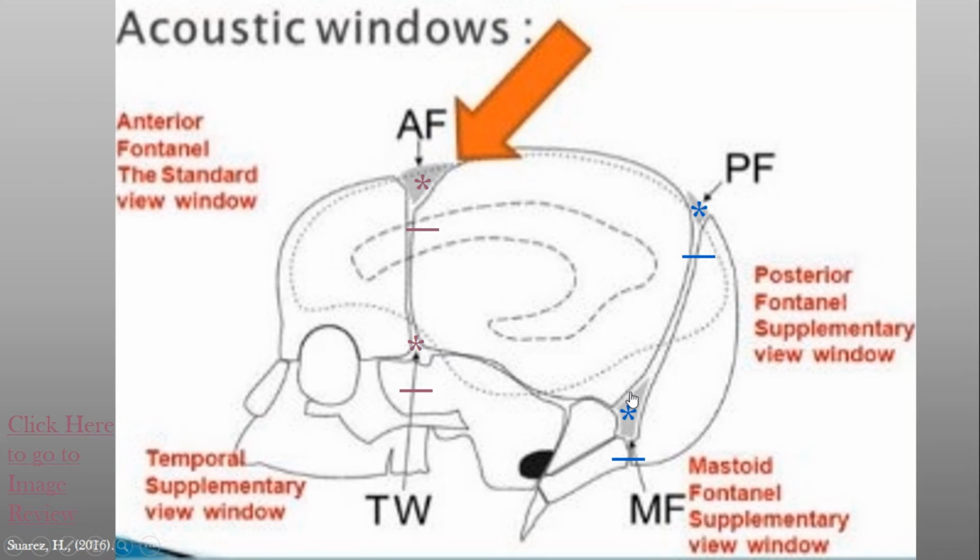So this is really meant to be completed independently to just get a feel for where your transducer is supposed to be, to put that 2D image into perspective with the three-dimensional object of a neonatal head, which is something that we do all the time. It's something that ultrasound techs have to do throughout schooling too. So even though this is two-dimensional, this is one of our fundamental ways to learn, which is why I think it will be pretty successful.